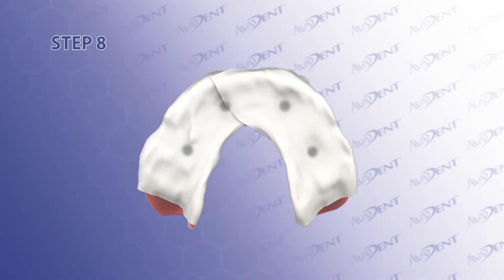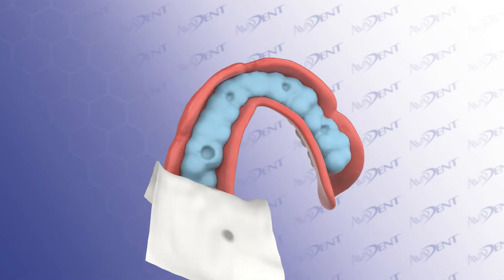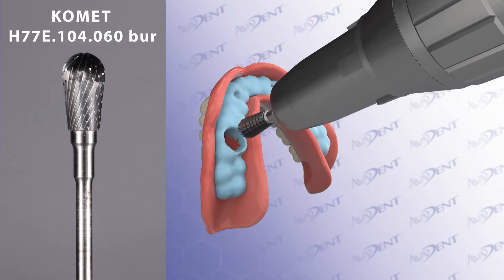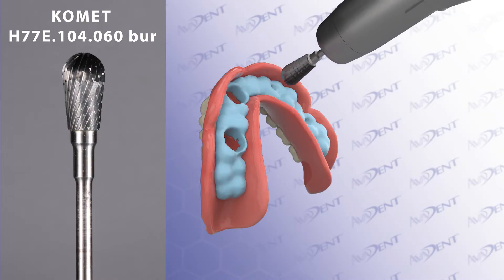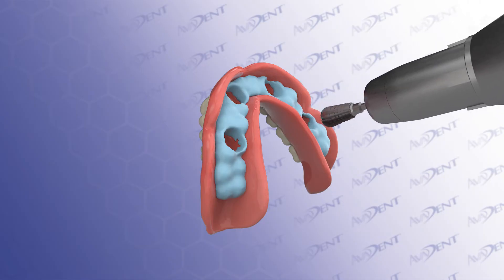Step 8. Once the bite registration has set, remove the PTFE tape and create 5.5mm deep wells into the multi-unit abutment marks in the bite registration. An easy way to do this is using a Comet H77E.104.060 burr, which is 6mm diameter and 11mm cutting length. Embed the burr half its cutting length in the multi-unit abutment mark.